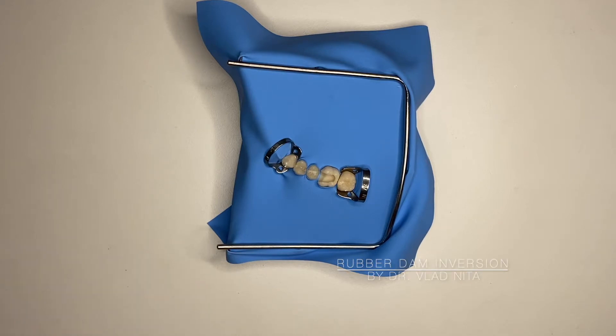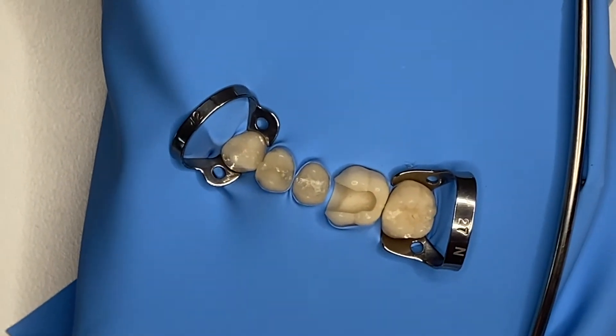One of our watchers recently pointed out that he has quite a bit of trouble taking a thick rubber dam between two teeth, and whenever he tries to do this, what he manages to do is to actually cut the rubber dam. This is quite common, but let me just try and give you a short fix for this.